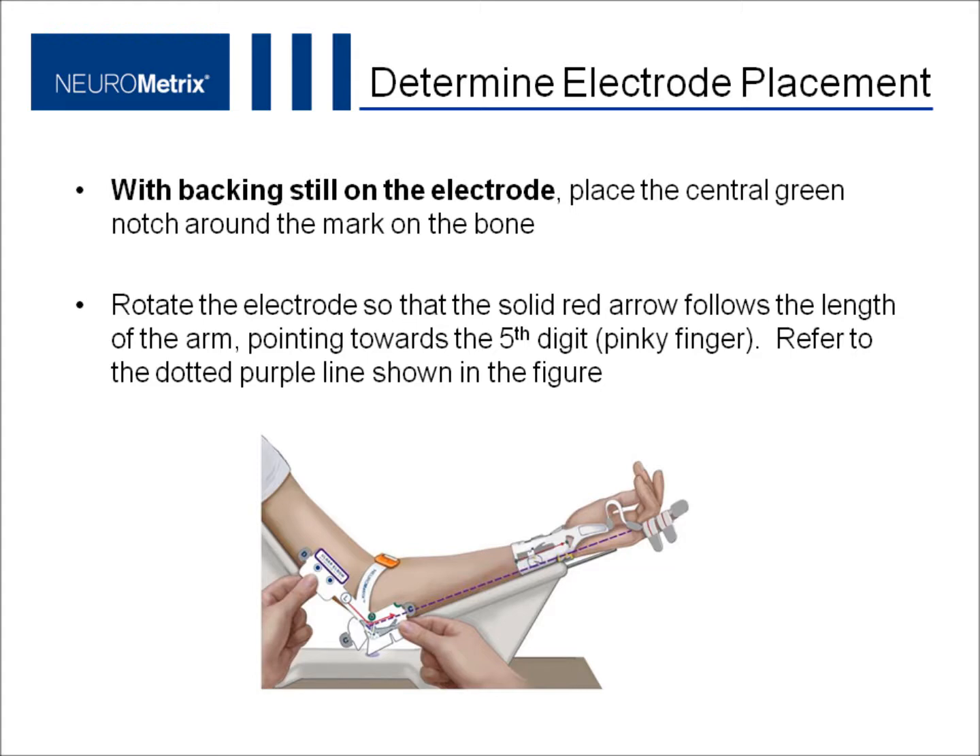Next, use the electrode as a template to determine the correct electrode position. With the backing still on, place the central green notch around the mark on the bone. Rotate the electrode so that the solid red arrow follows the length of the arm, pointing towards the fifth digit, the pinky finger.